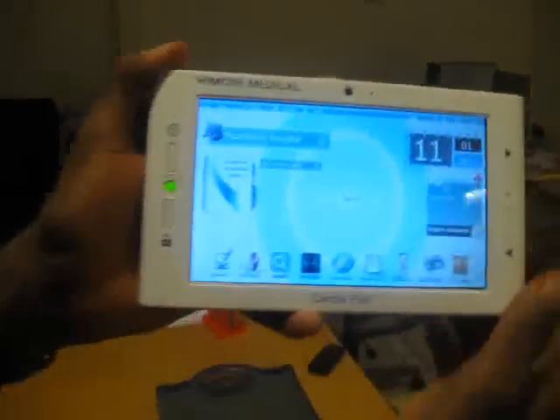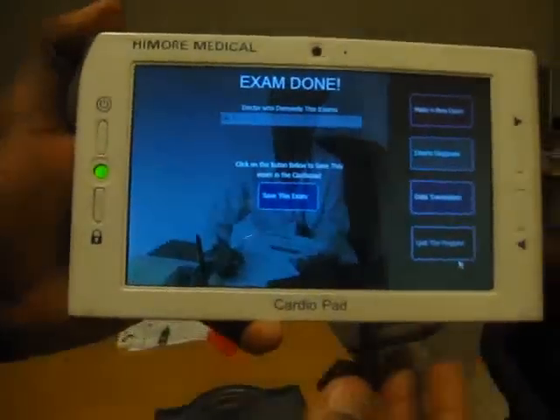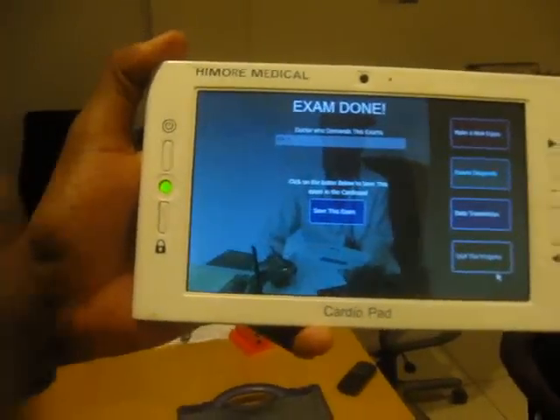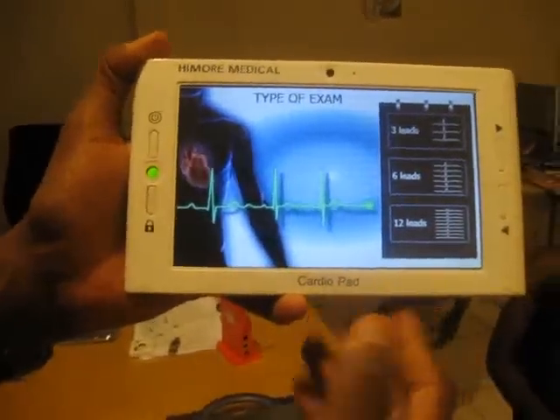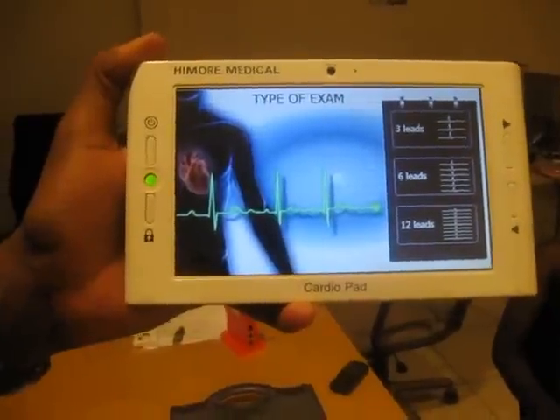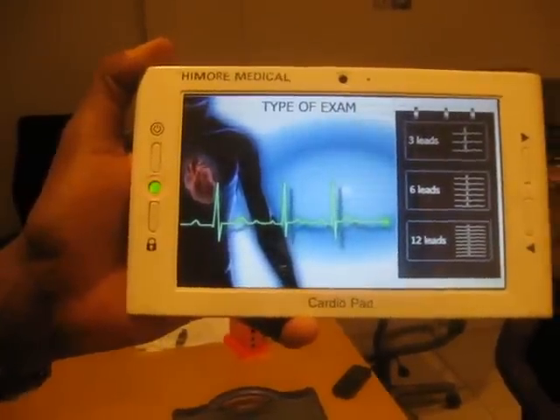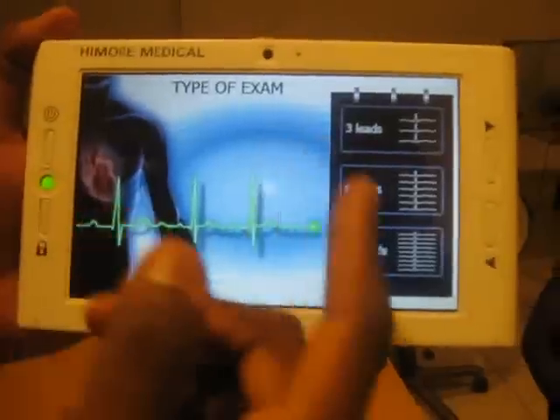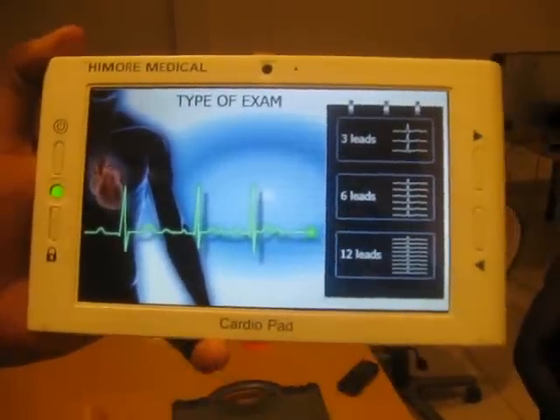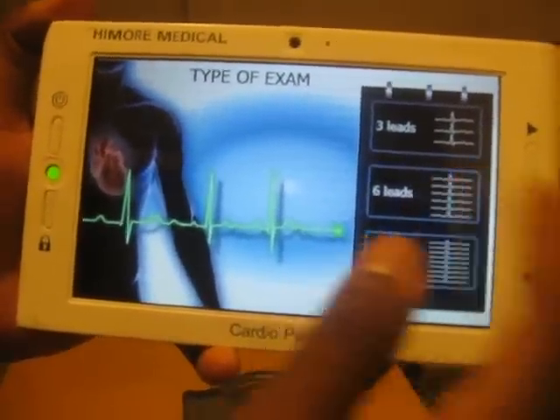In the following step, the nurse will launch a program called PartECG Exam, which will allow performing an ECG examination for this patient. The recording of the examination is done in many steps. In the first step, the nurse will choose the type of examination, which can be 3, 6, or 12 leads. For this demonstration, we will choose to perform a 6-lead ECG exam.